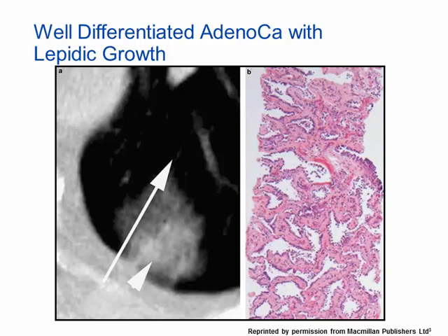What is the reason? The reason is that we do not know exactly where the biopsy was taken from. If you look at the left large arrow, this biopsy is likely taken only from the ground glass opacity, which is likely only the in situ component. However, if the biopsy was taken from the side of the small right arrow, this is the solid component which likely will show the invasive carcinoma.